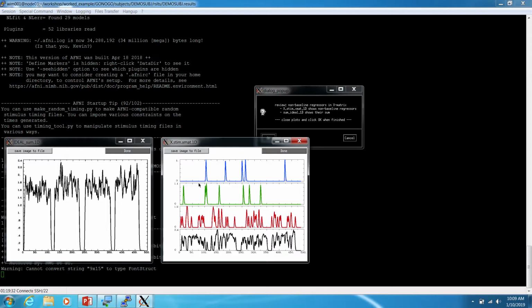What this is, is that convolved with the hemodynamic response. So remember when I was talking about how you might have an event and a couple of TRs might be censored within it due to motion or something? This is how that happens, because it takes time for the blood to move through the tissue and then move out. So in this case, everything that's above 0 here is getting counted in some way as in this regressor.